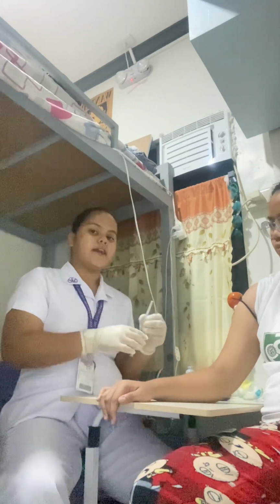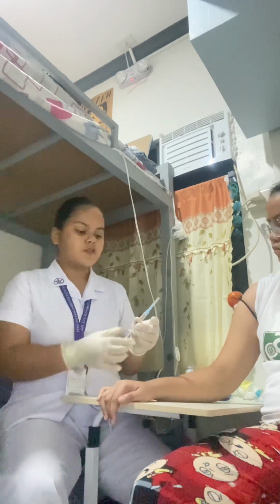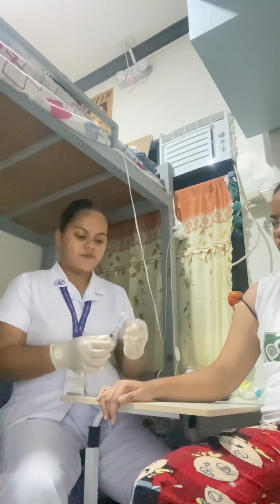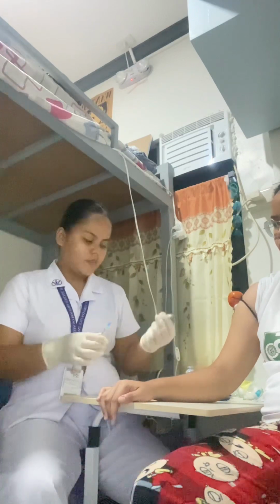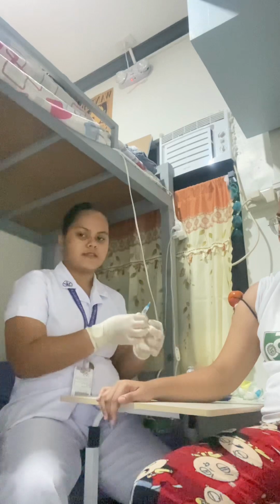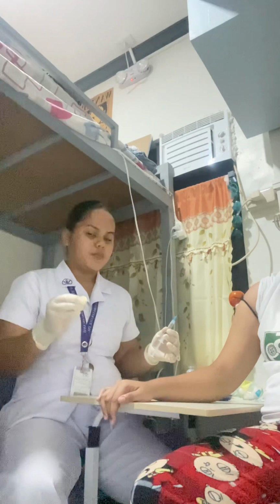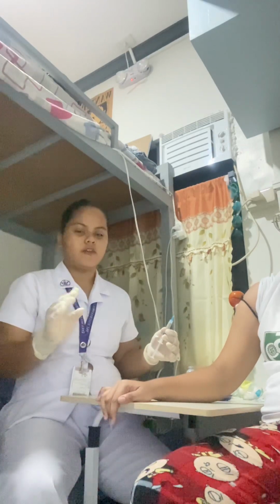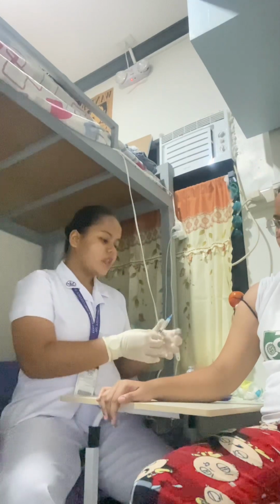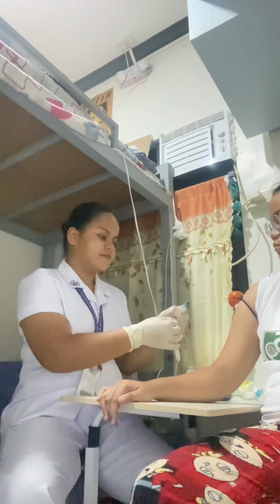Earlier I have performed how to withdraw a medication from a vial and ampule. So this is the medication I have withdrawn. After that, I'm going to remove the cap without contaminating it, making sure that the needle is kept sterile. If it's a pre-filled medication, be cautious and avoid dripping of the medication. If it drips, wipe it off using a sterile gauze, because the medication can cause pain.